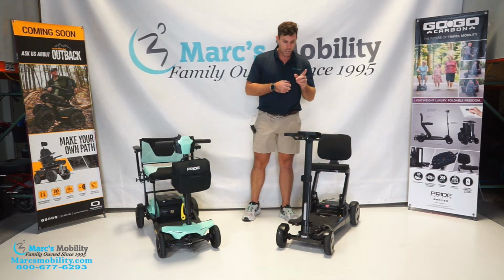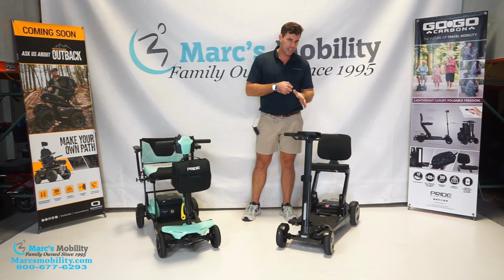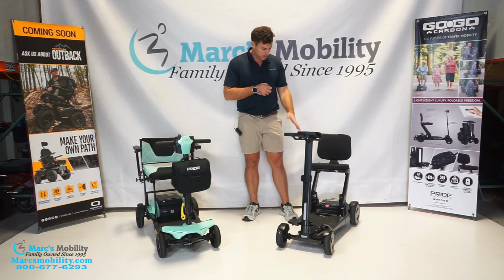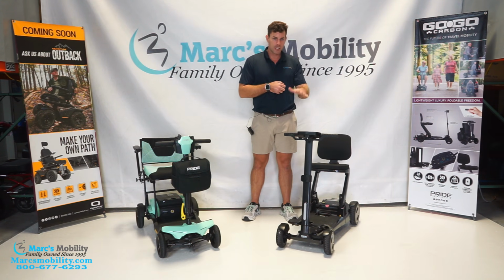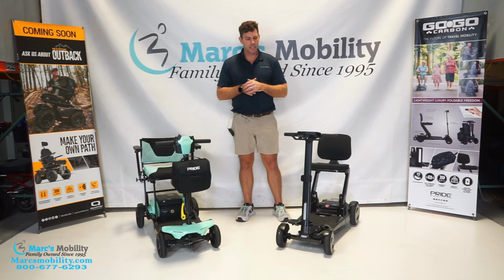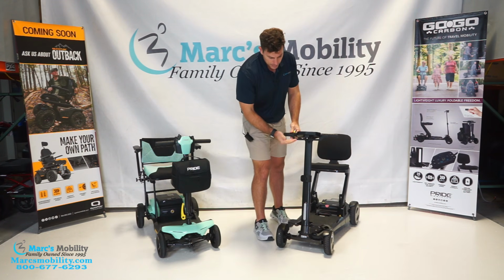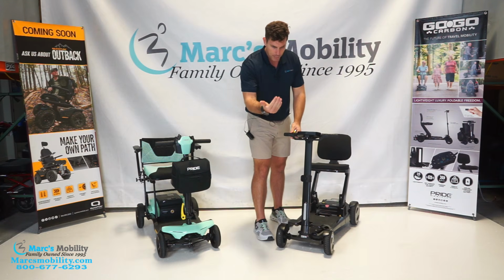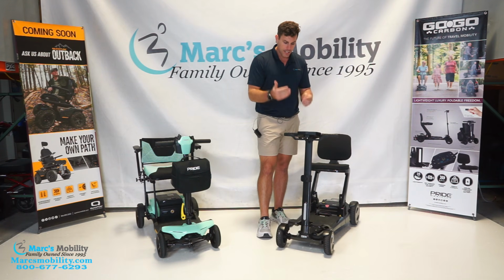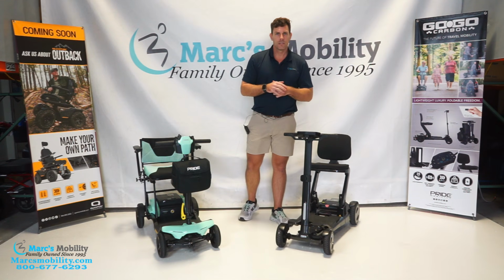One other pro on this unit is that when it is folded, it is not going to have any real resistance with the motors because you're on anti-tip wheels, so it is going to roll around easier, more like a suitcase if you were to pull it behind you. One other thing that I forgot to mention, one drawback on this unit, is that although your tiller is height adjustable, there is no adjustment for the depth forward and back towards you. So it is always going to be at this fixed place on the GoGo folding unit.